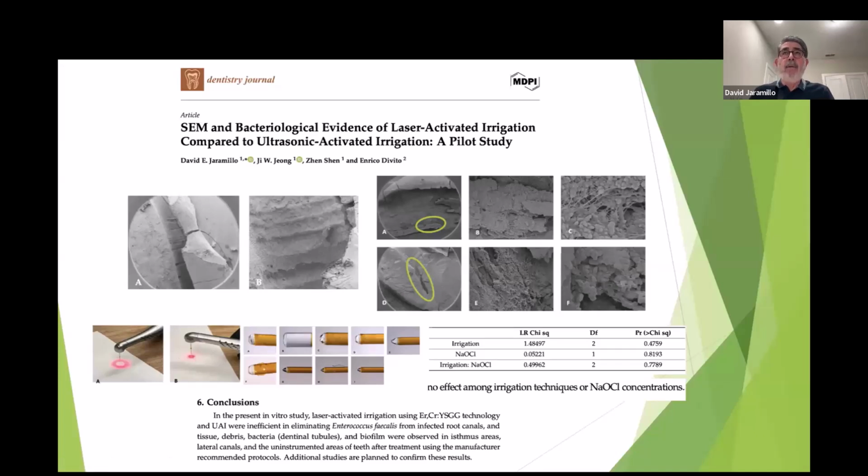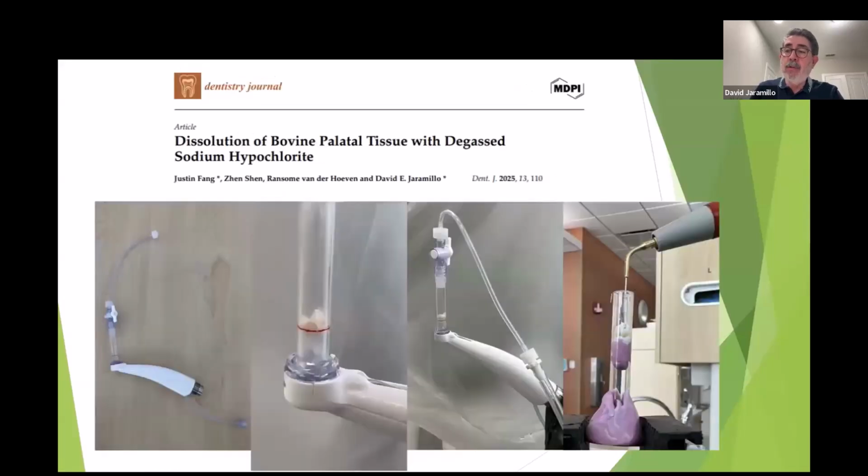We measure the power of the laser before and after, and there is a big difference in the power that is coming out at the tip of the laser because of the degradation of the tip. So I don't know if you are a laser user. I don't know if you were aware of this, but this is something you really wanna know about, because these tips cannot be reused. Actually, I don't recommend you to reuse it.